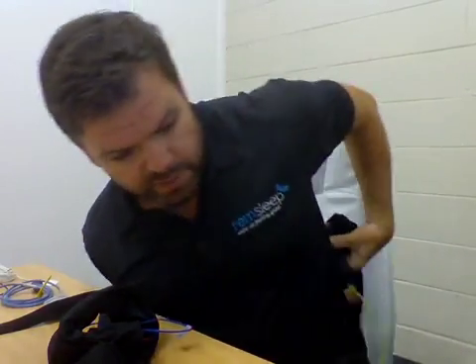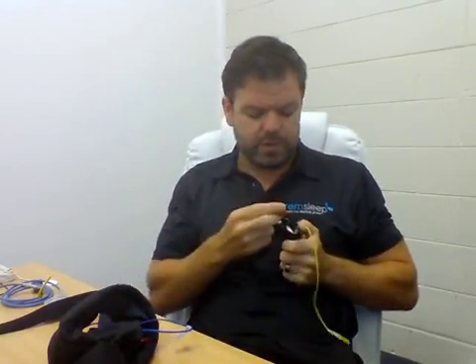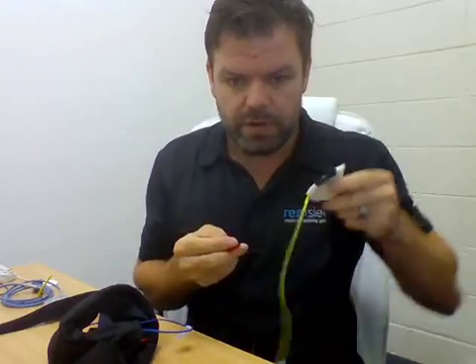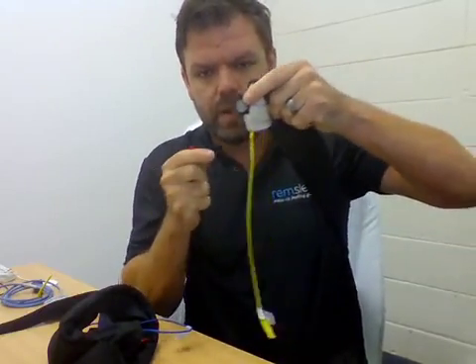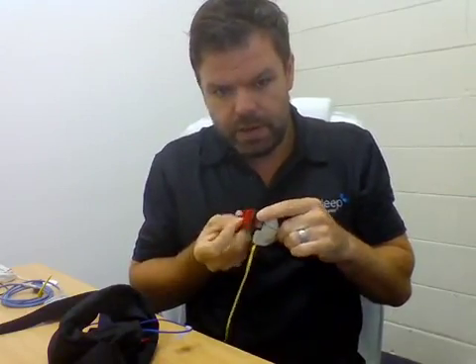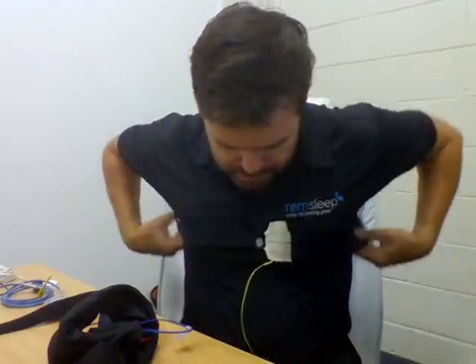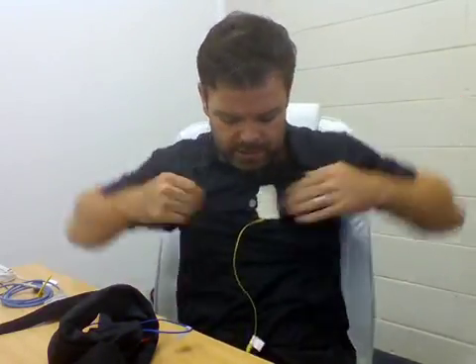Here. And what we're going to do with these is the yellow one is going to go around our chest. So if you've got someone to help you with this, you can get them to pass it round. Otherwise, it's not too difficult to do it yourself. And what we're doing here is this has just a little buckle sort of thing here. And I'm just going to pass through this and back around in itself. So you can see that there, it's just around my chest.